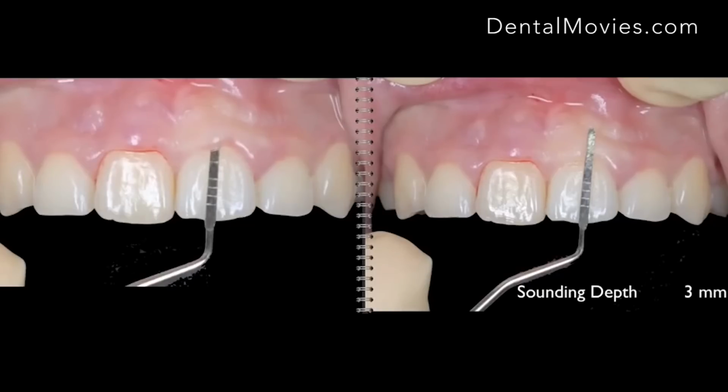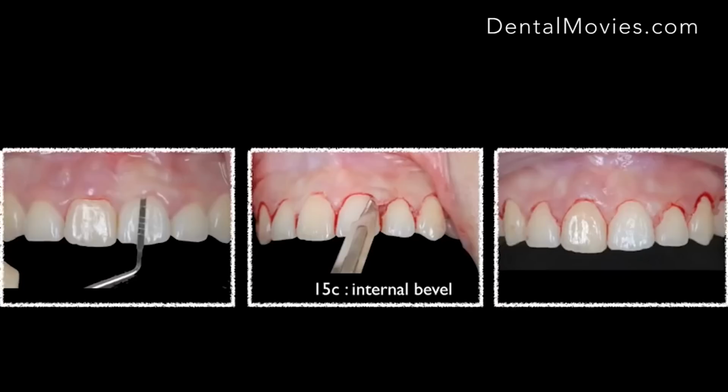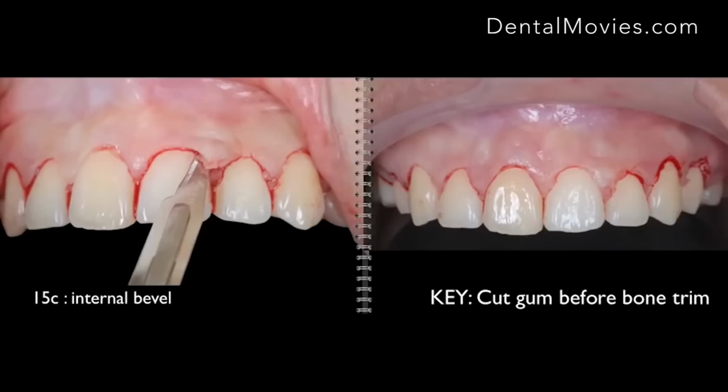Sihan, you have to listen carefully. I'm going to do a surgical crown lengthening on your tooth. You get a 15C blade and make an internal bevel to cut the gum. You always cut the gum before you trim the bone. So before you raise the flap, you're supposed to cut the gum first.